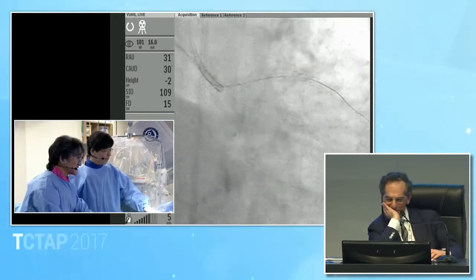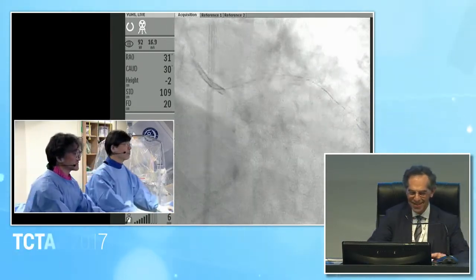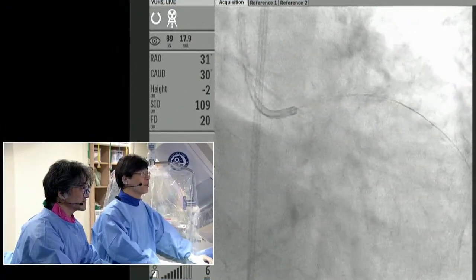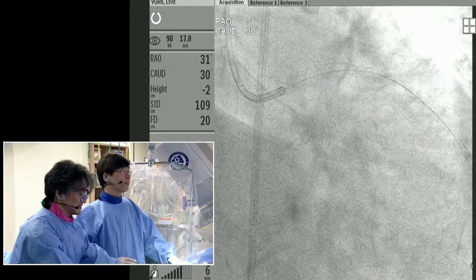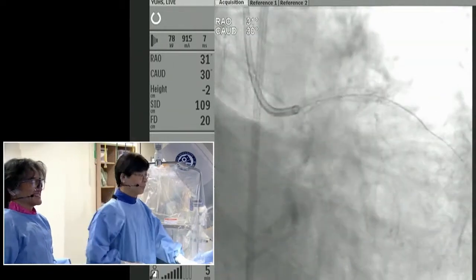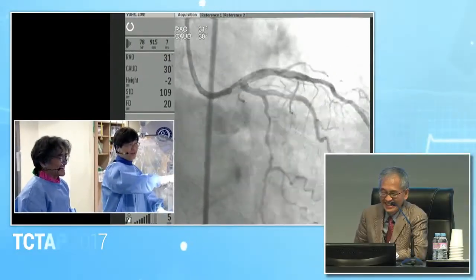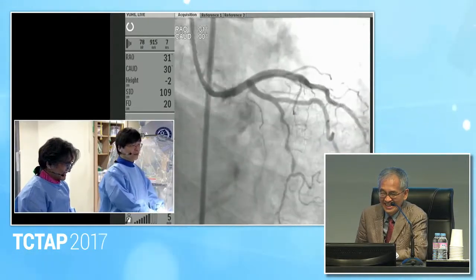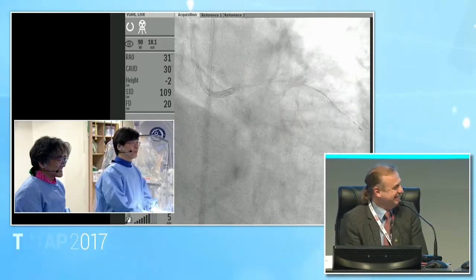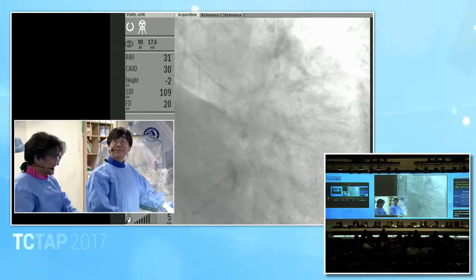Okay, I will do that. Engage the catheter, and then remove the wire and engage the catheter. Almost there. Okay, start. Oh, fantastic. Actually, you did not count this contrast. The results were inside the angio technique, and the lower contrast was not necessary. But at least they convinced us. Almost zero contrast. I'm happy that we agree in the end.